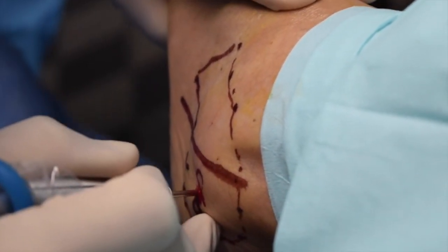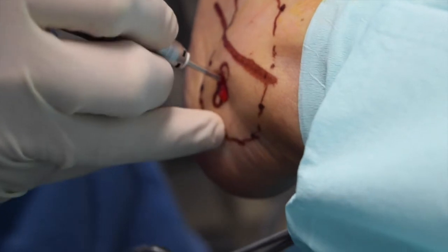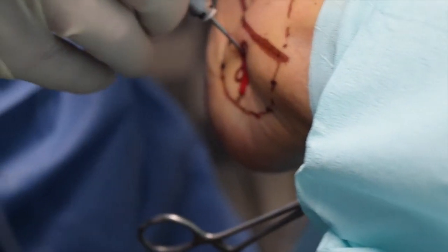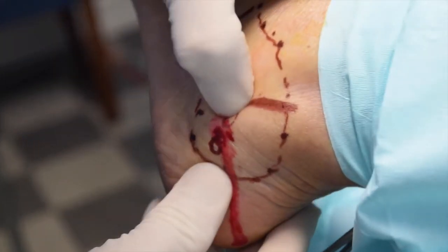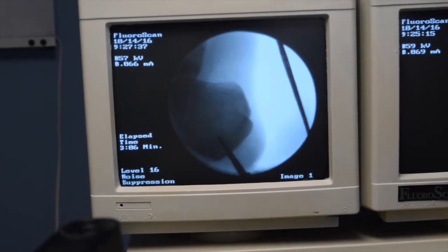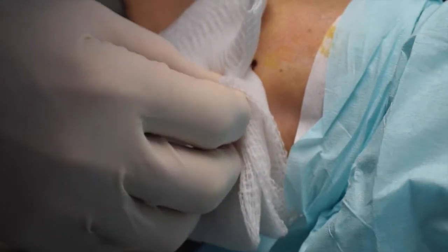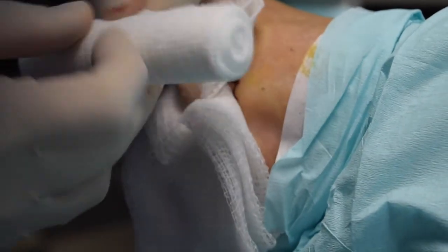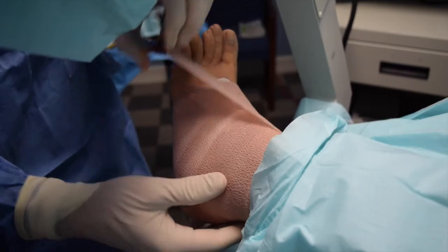We check our C-arm to make sure things are okay. Now we angle about 45 degrees and make an anterior pass in this direction. Then lastly we do another pass into the other part of the inflamed area. Basically you're done — you're letting the heel bleed out; there are no sutures put on this. We check the C-arm again to make sure the cortex is good, then put a fluffy bandage on. The bandage has to be fairly large so that any bleeding is captured within it. That's the extent of the surgery — it's very quick and allows treatment of patients with congestion and inflammatory heel disease.